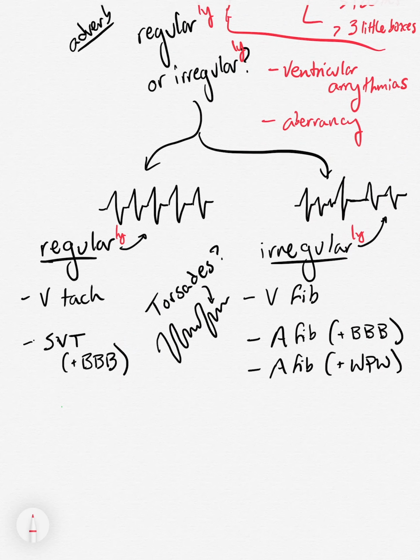So, if something is regularly irregular, it might have a funky wave, however, it is spaced evenly across time. If something is irregularly irregular, it has different morphologies, right? So, with that definition, what's a torsades? Well, the interwebs disagree. Multiple sources have conflicting information, so we put it right in the middle for you.